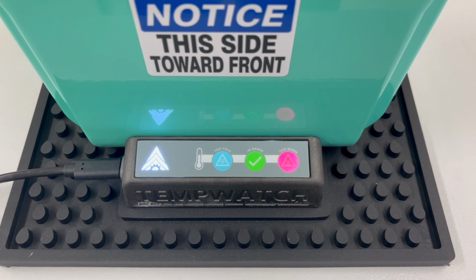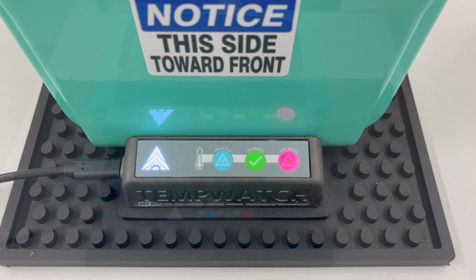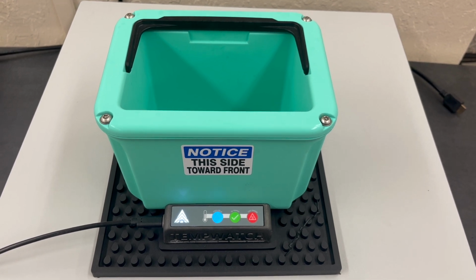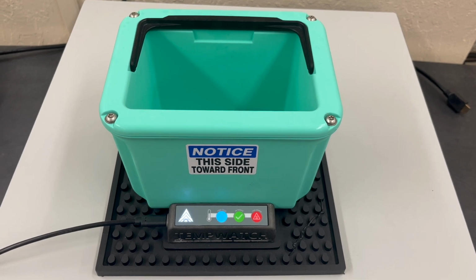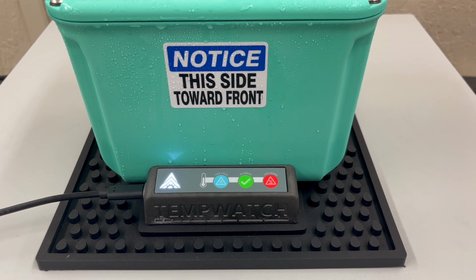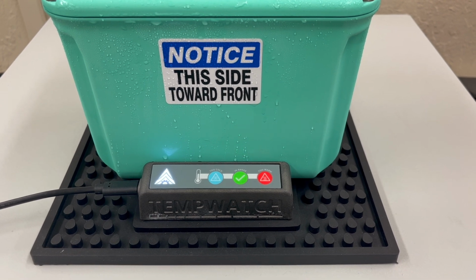One reading can be this, where it's too hot. It's unlikely coming out of the freezer that it'll be too hot, but you cannot use the insert if it's too hot. The other reading you may get is this one that indicates that it's too cold, and that is the one you're more likely to get. If you get one that says it's too cold, just leave it there, and what it's doing is warming up to the environment around it. It's getting, quote, conditioned. When it has reached 2 degrees Celsius, you will get an audible and a visual alarm. The green check mark blinks, it makes a sound, and this thing is ready to go into your box.